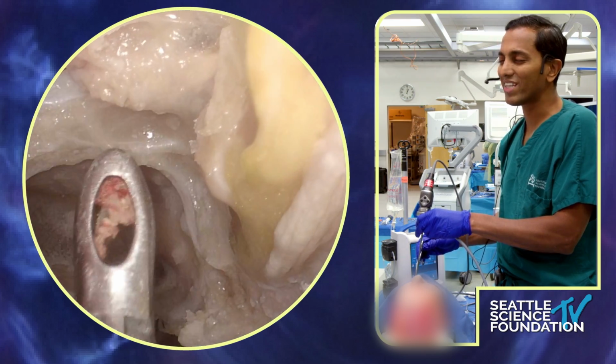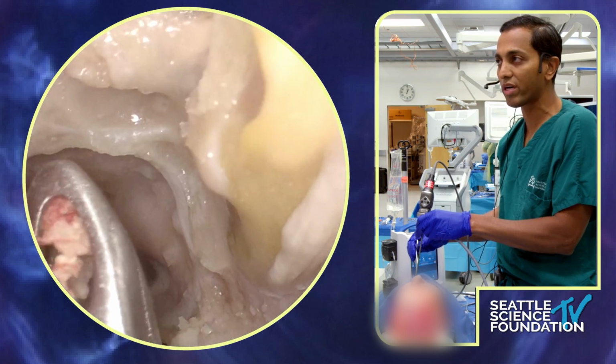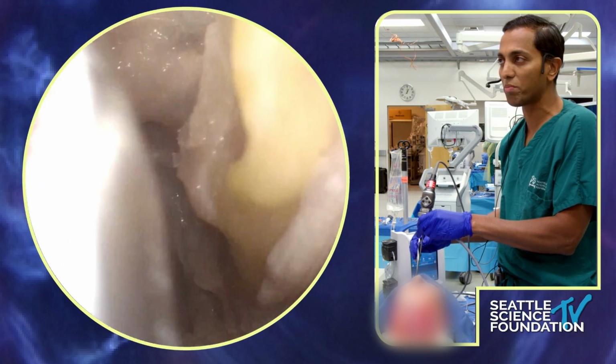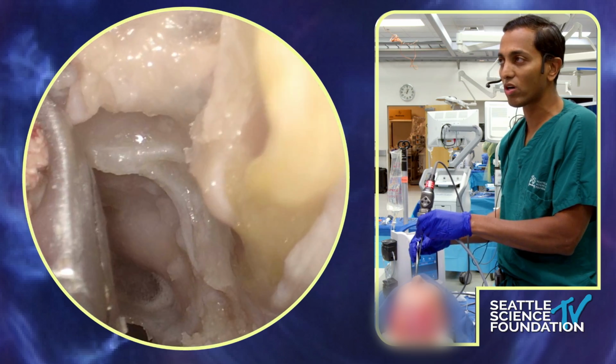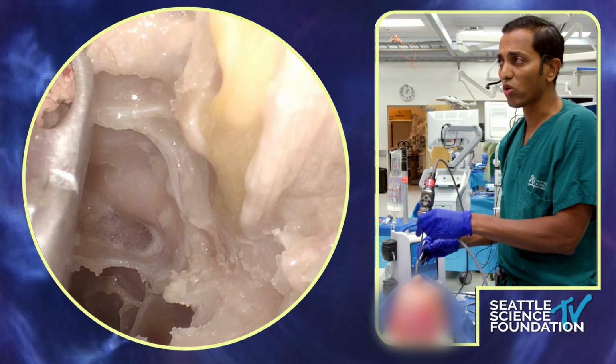First thing you would do, and with these cadavers you'll probably already be done, but you want to strip all the mucosa around there. Again, ours is already done, but you want to strip all that mucosa around it. Once you strip the mucosa around it, you can really see where our bony defect is and where our dural defect is. So then the next step is, what are we going to use for grafts?